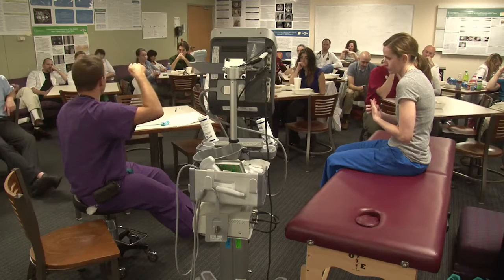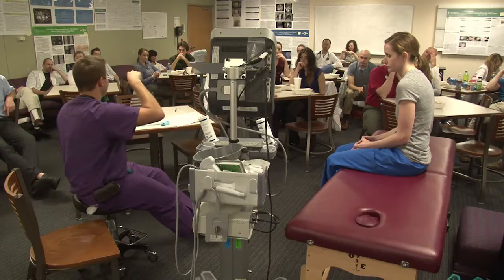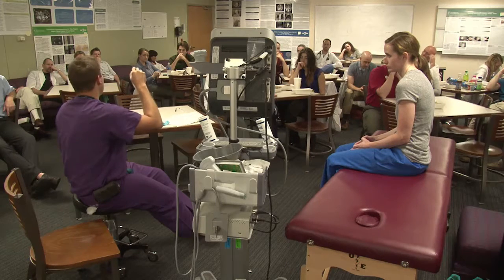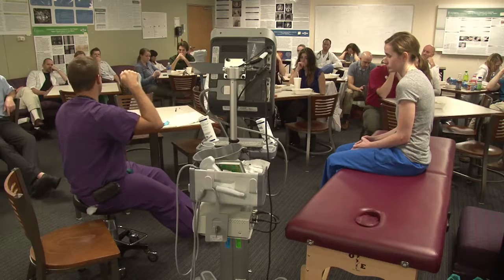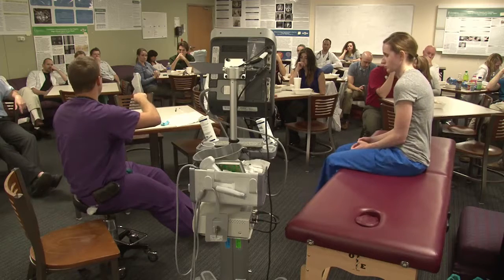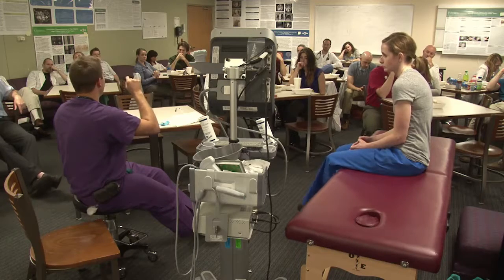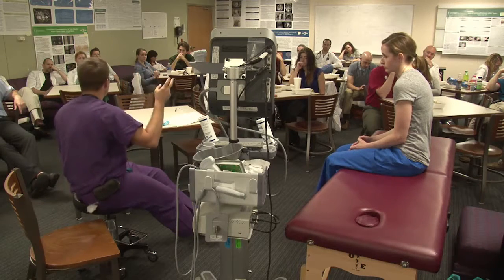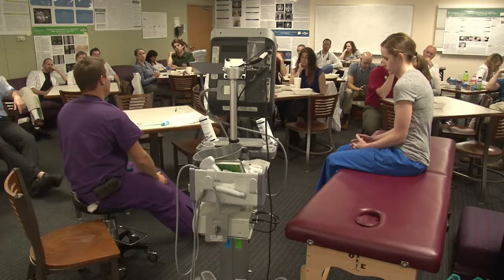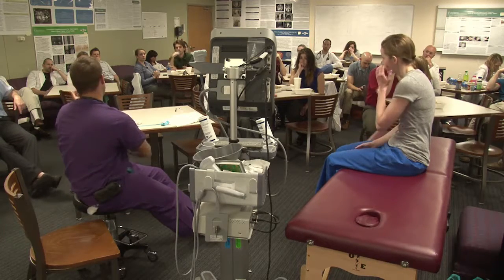And when you're seeing it just over the top of the vein, okay, if it's over top, you're like, well, I see the shaft of the needle, it's over the top of the vein. You have probably gone too far, meaning your needle approach is too shallow. You might strike the vein, but it's going to be a long ways away when you actually cannulate the vein with the bevel of the needle, and you're not going to have very much slack to actually thread the catheter. So the catheter in that juncture might be literally a millimeter or something in the vein, and that's better than nothing, okay? But that counts as tenuous.